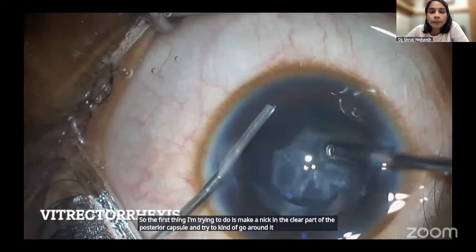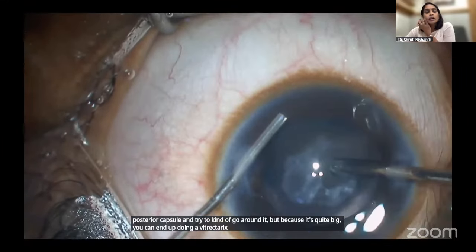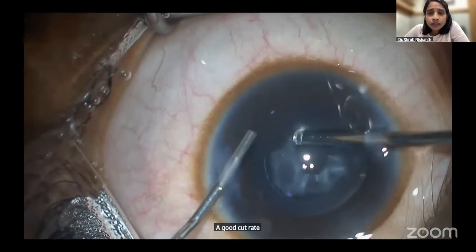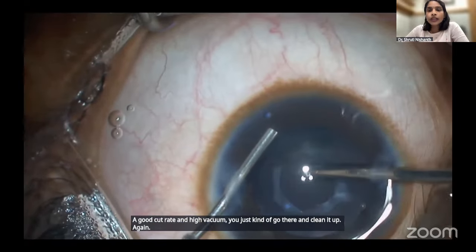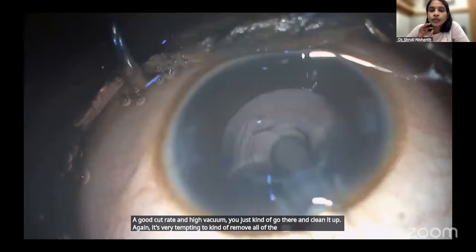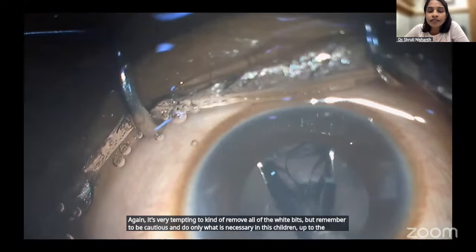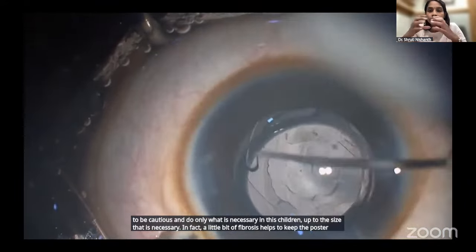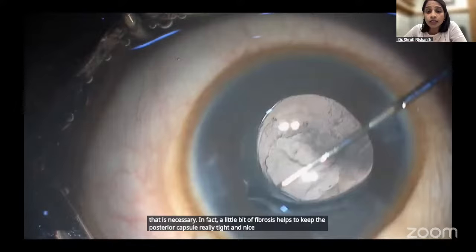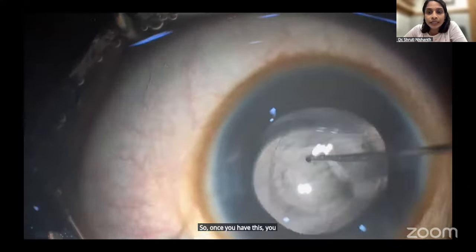But because it's quite big, you can end up doing a vitrector rhexis, with a good cut rate and high vacuum. You just go there and clean it up. Again, it's very tempting to remove all of the white bits, but remember to be cautious and do only what is necessary in these children, up to the size that is necessary. In fact, a little bit of fibrosis helps to keep the posterior capsule really tight and nice, and doesn't allow for extension. So once you have this, you have an IOL nicely in place.